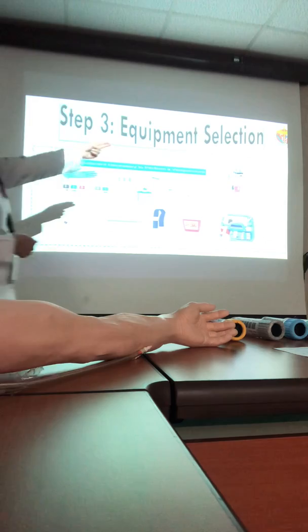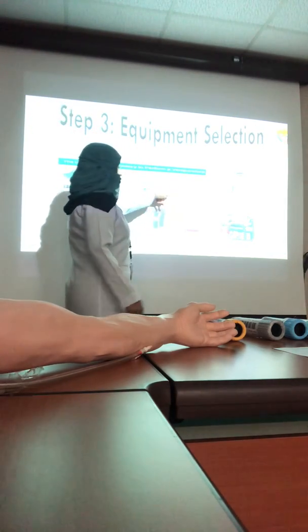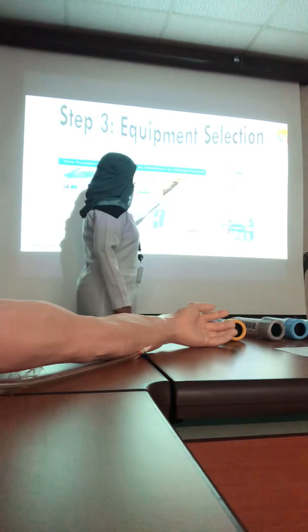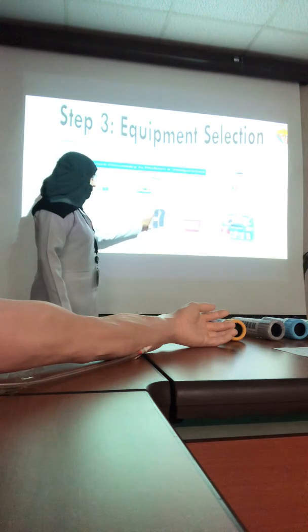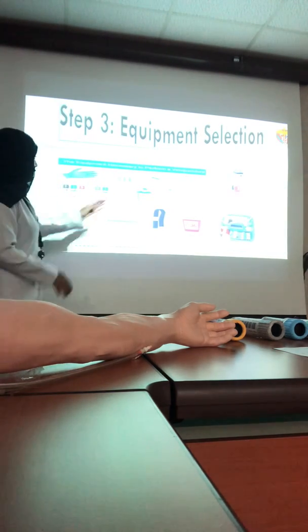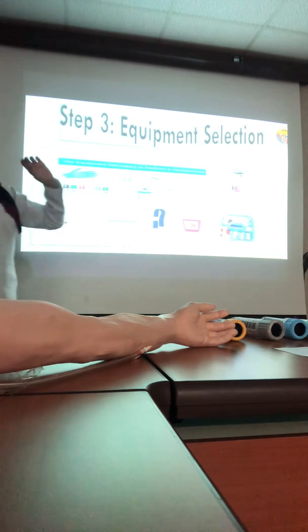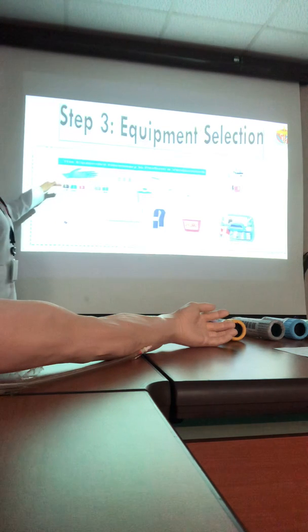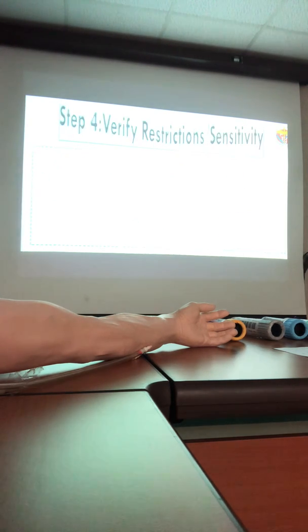So the clean tray or trolley, this is the holder, different sizes of syringes. This is the closed system and this one the open system. Sharp container, tourniquets can be like this or single-use tourniquet like a rubber. Different sizes of needles or butterflies, different tubes, alcohol swab, bandages and gauze, and of course request form.